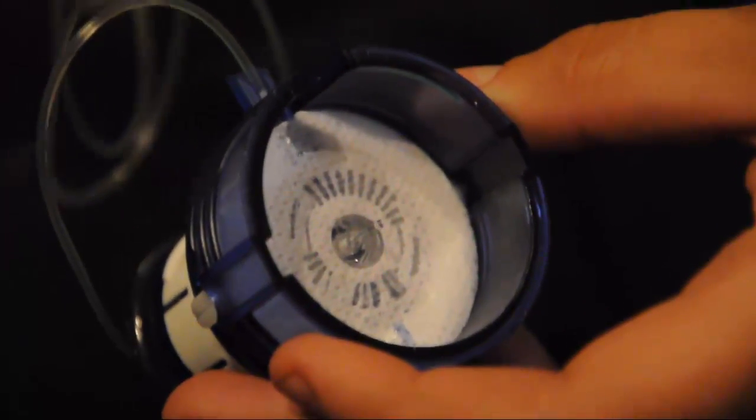So once you see the drops coming out the end, press the escape button, and it will say, do you see drops at the end of the tubing? Scroll down and press yes, and then now I'm ready to connect the set to my body.